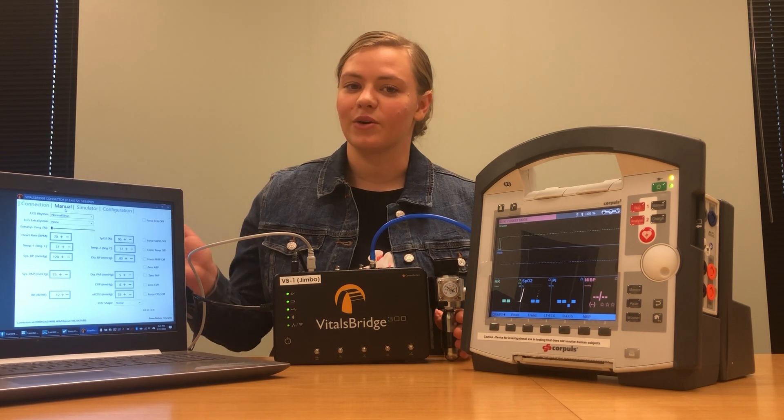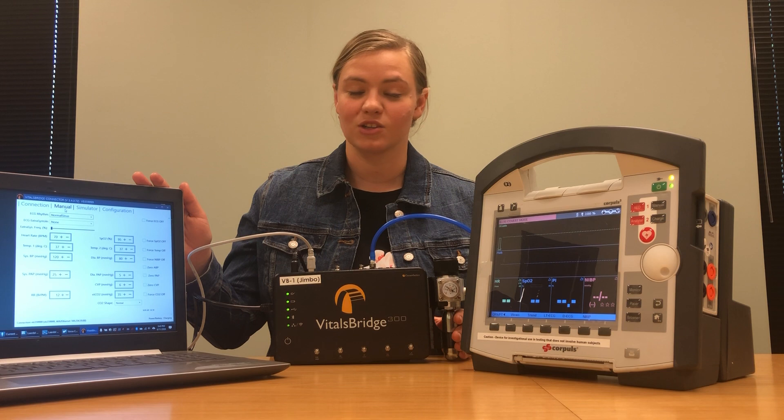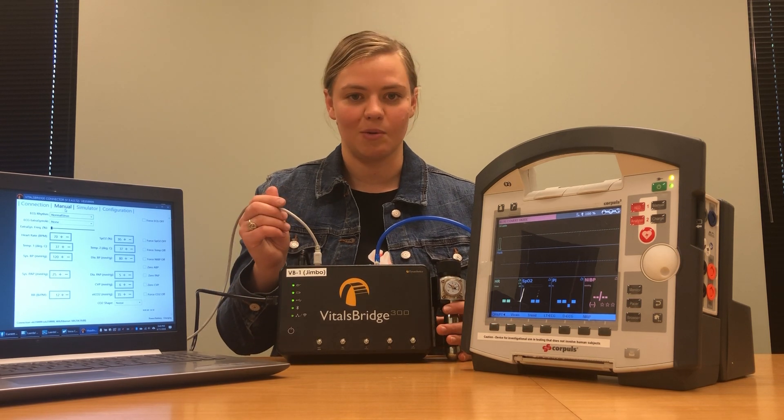Before starting this video I downloaded the VitalsBridge connector software to my laptop from vitalsbridge.com/downloads. I also connected my VitalsBridge unit to my laptop via a USB cable.